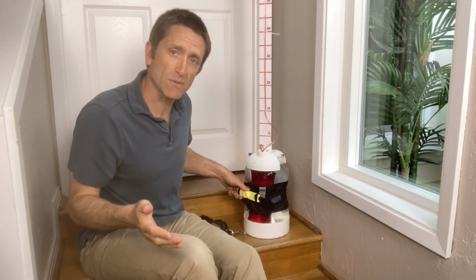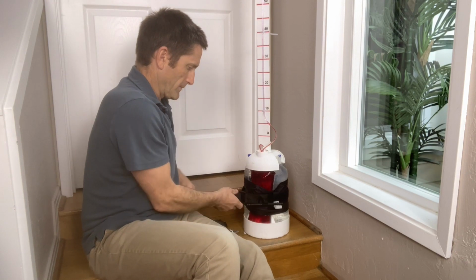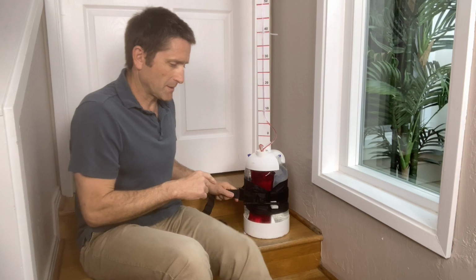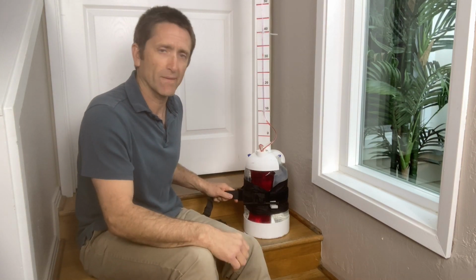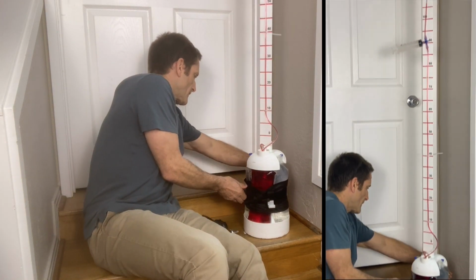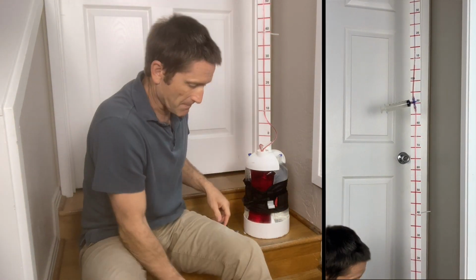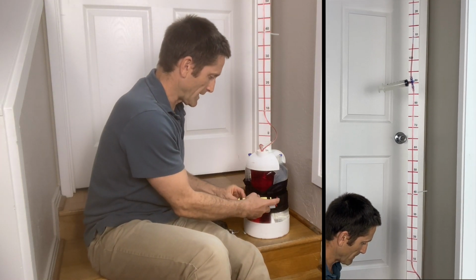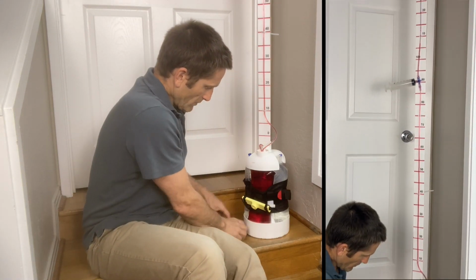So let's see what happens with 2 CAT-like products. All right, so this is one of the products. You can buy 5 of them for $20, $25 on Amazon or eBay. I crank it down, and I can get, all right, that's not bad. Let's say 105, 110. I attach my adapter here, and let's start to see what kind of torque we get.